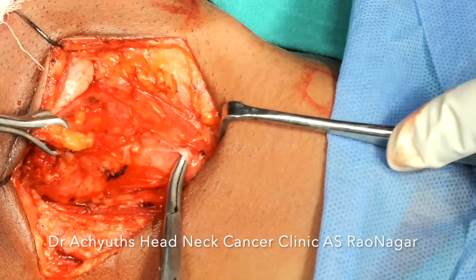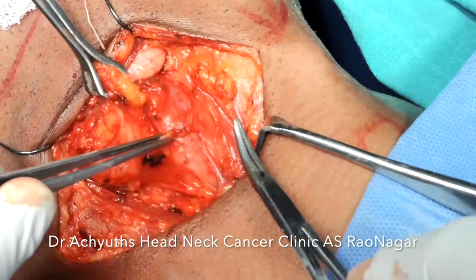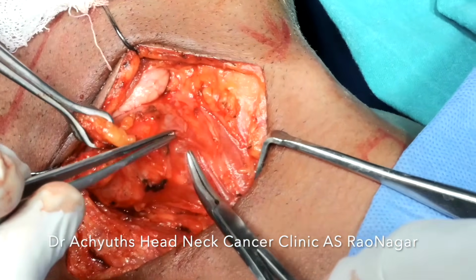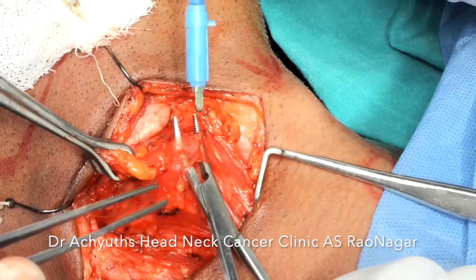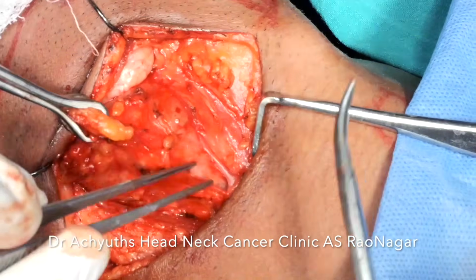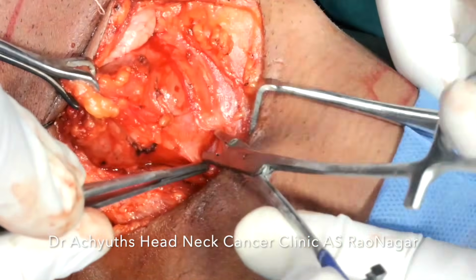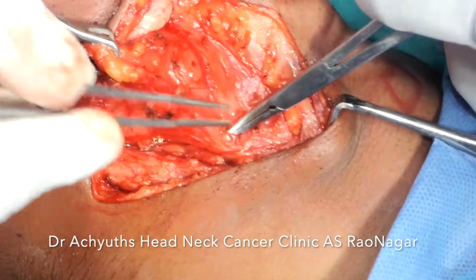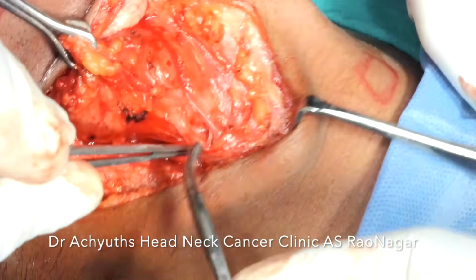As I told you, you cannot get the entire surface like the medial wall or the lateral wall directly detached from its attachments. So every time you have to come from all the sides, divide it layer by layer, and then come. There are little vascular structures which require suture ligation. They are ligated.